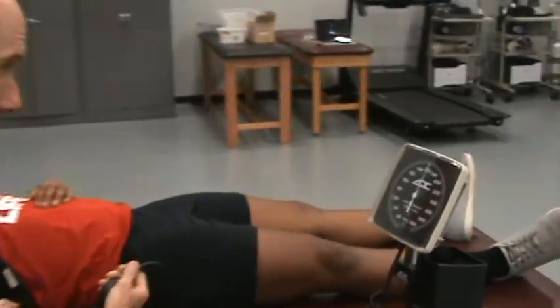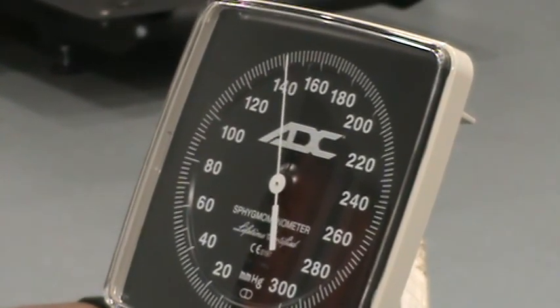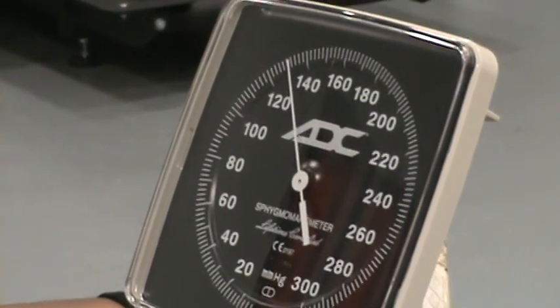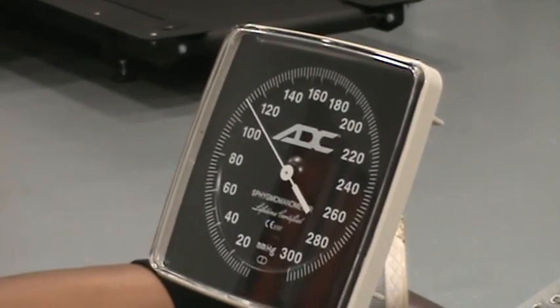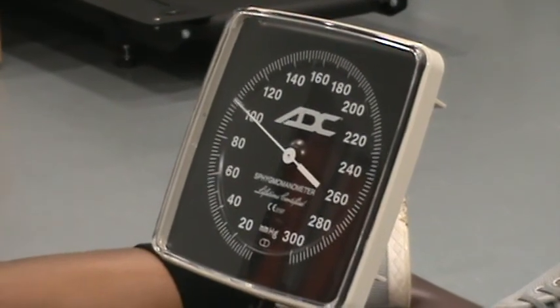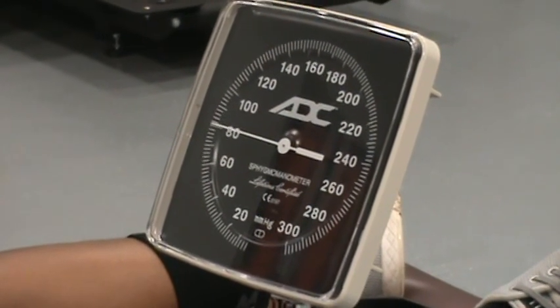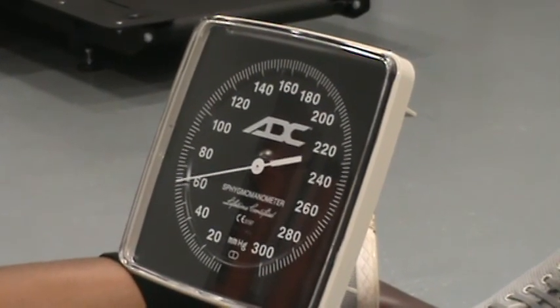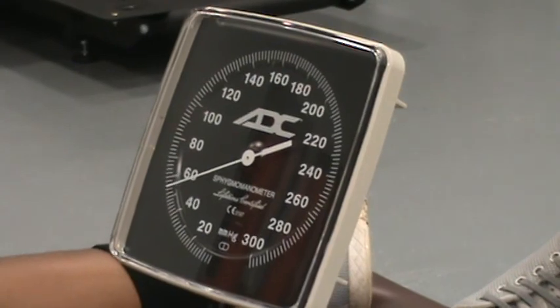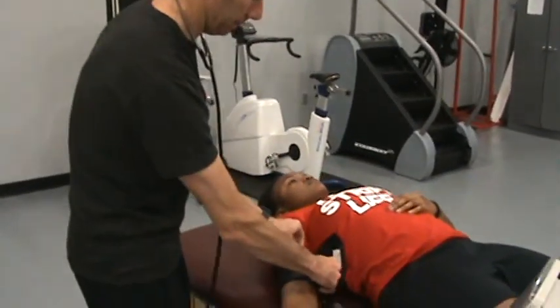To 160, immediately open it. Nice slow drop, listening for heartbeats. So there's the first one, 118. You can hear a steady heartbeat now. I'm going to listen for the last beat. All right, so then the beat disappears, I'm going to open the valve all the way up, take my stethoscope out, and go ahead and remove the cuff right away.